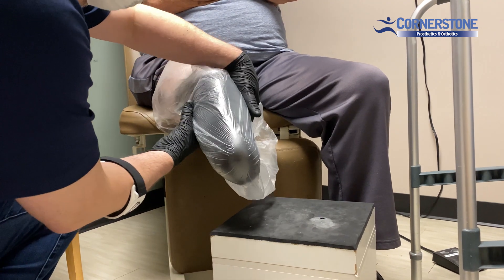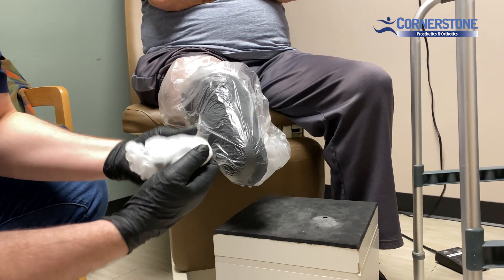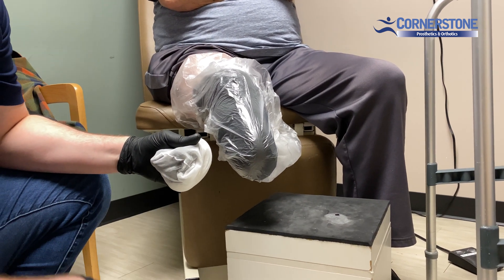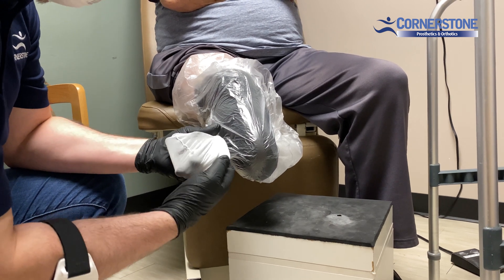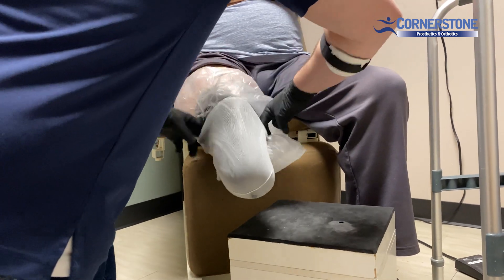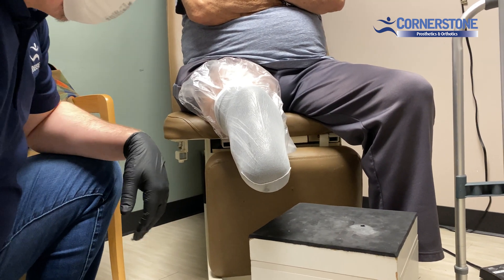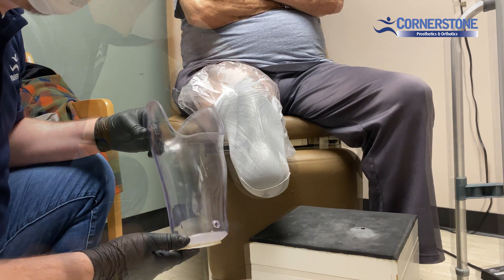Try to make sure there are no wrinkles in it. That's the base, and then we're going to take a nylon and run the seam at the base in a horizontal or vertical position so that if the silicone pad ever comes out of the socket, you know the orientation of the silicone pad. In this case we're going to run it side to side. The nylon also acts as a wick so that as the silicone is injected into the base of the socket, air can escape out the top so you don't end up with any air bubbles.